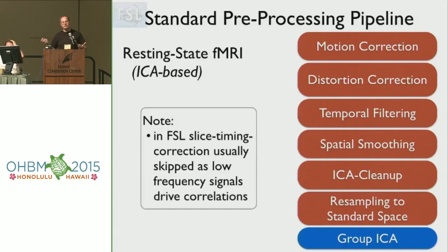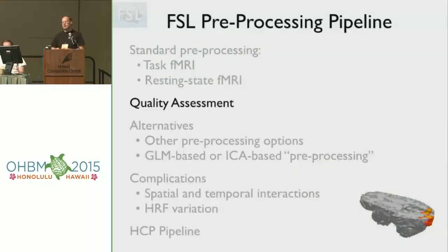And you'll notice that I haven't talked about slice timing correction, which we did in the GLM before, but we're not doing that here. We just basically stick our head in the sand on that generally and say that because the low frequency signals are the ones which tend to drive the resting state correlations, there's not a lot of benefit in doing it. And certainly in our hands, we haven't seen a lot. So we tend not to do it, but it is there if you want to do it.